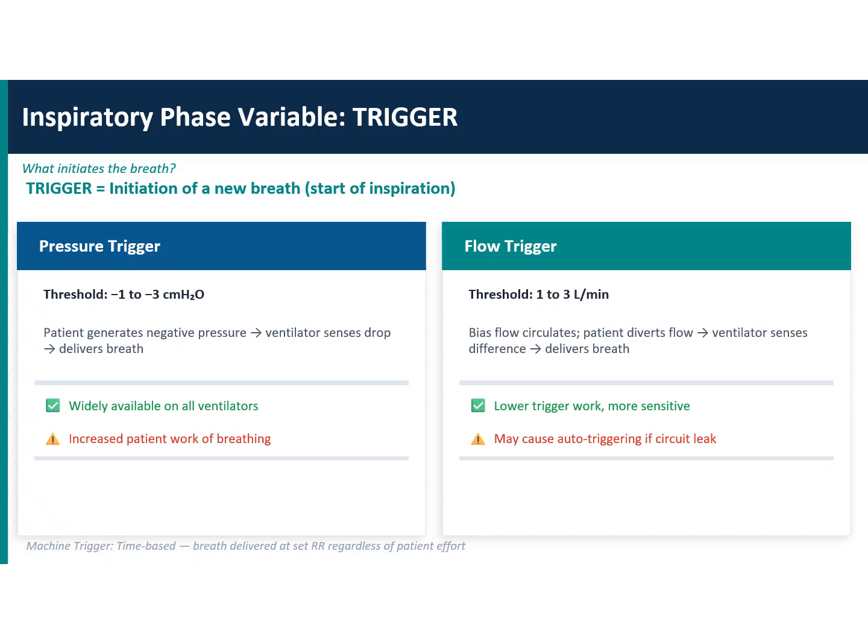And it is important not to set the trigger very high also, because the patient will try to breathe but is not able to reach that trigger. So there will be very high work of breathing.